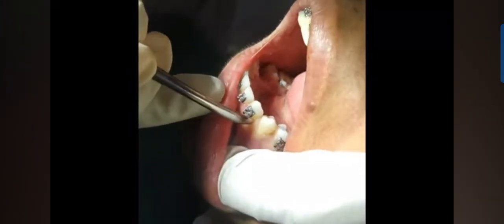Now give a digital compression with your fingers to reapproximate the buccal and the palatal plate as the alveolus is expanded due to tooth extraction. And then quickly take a gauze piece and fold it into smaller parts. Then place the packed gauze into the socket and ask the patient to bite it tightly, tooth to tooth. We do the same procedure for the mandibular premolar.